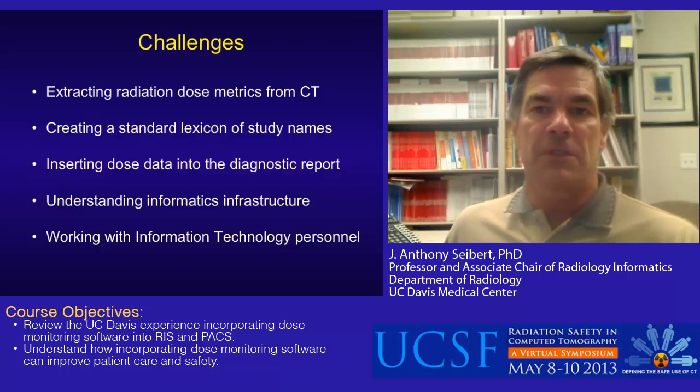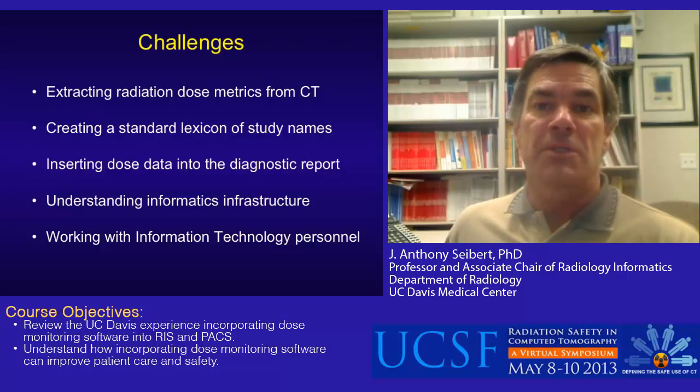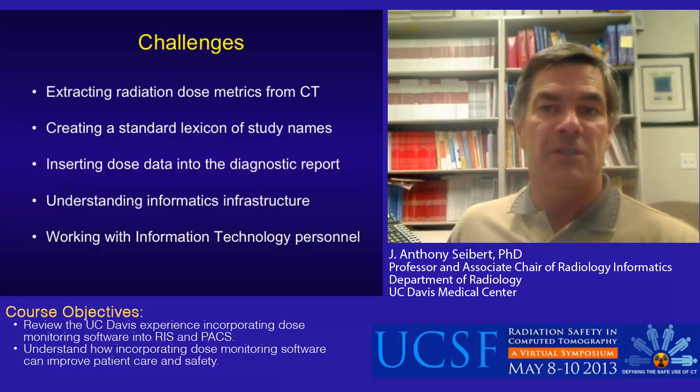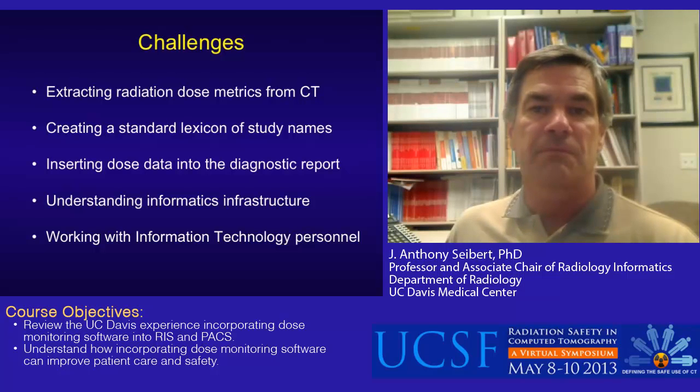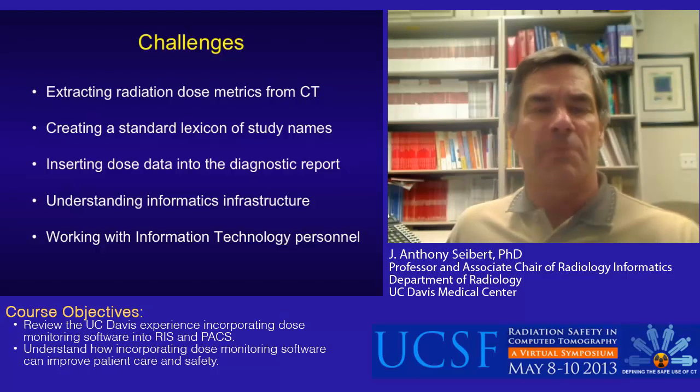Inserting dose metrics into the interpretive report is also a challenge, since the radiology information systems in common use have inflexible database structures. In addition, understanding the informatics infrastructure and working with IT personnel can also be very daunting, as they often see things from a different perspective.